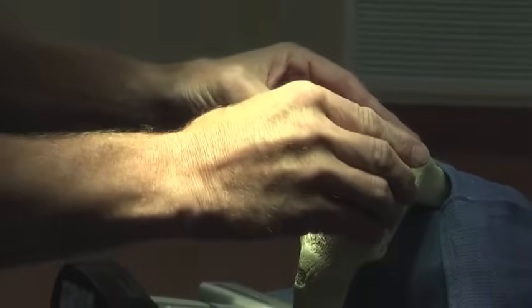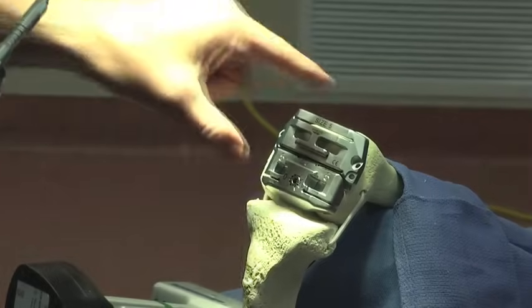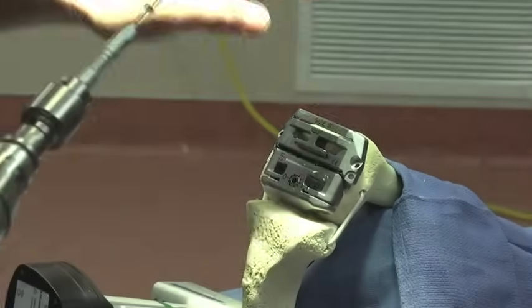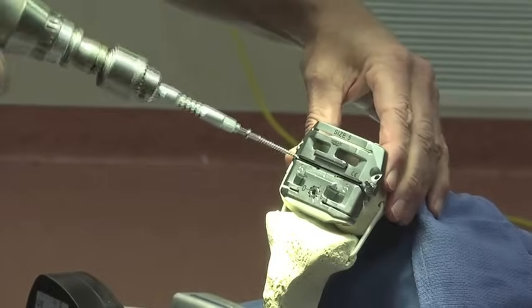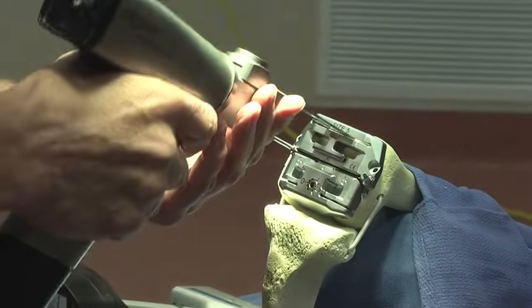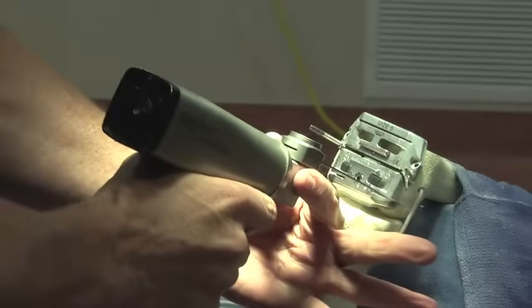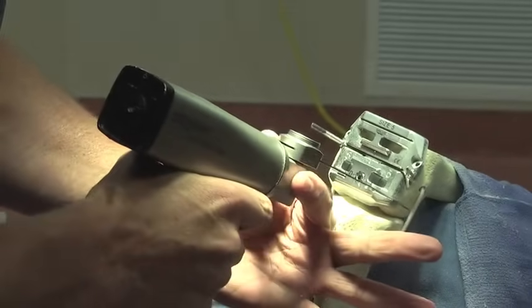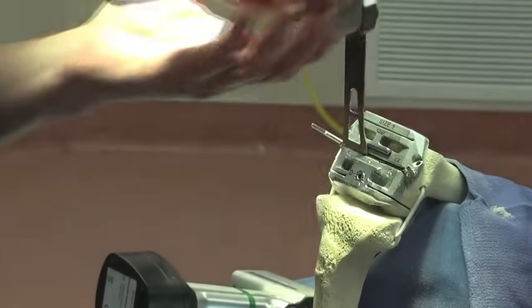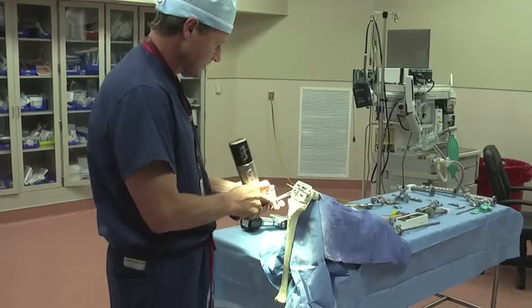Then we'll put on our cutting block next, and pin that in place to keep it stable. This block will make our front and back cuts and what we call our chamfer cuts. We'll use two pins to stabilize this block and go ahead and make these cuts, starting on the top here, then making our chamfer cuts.